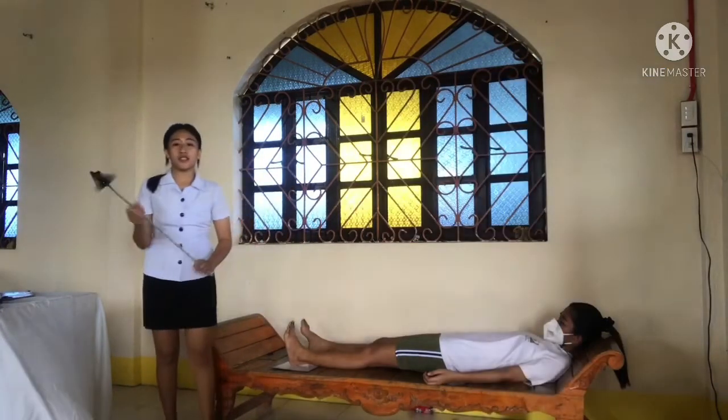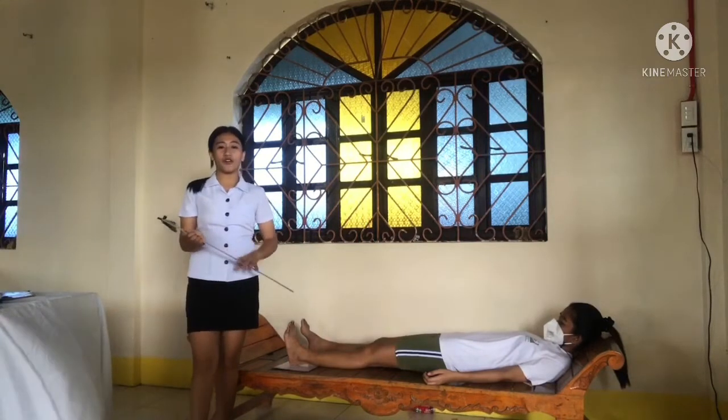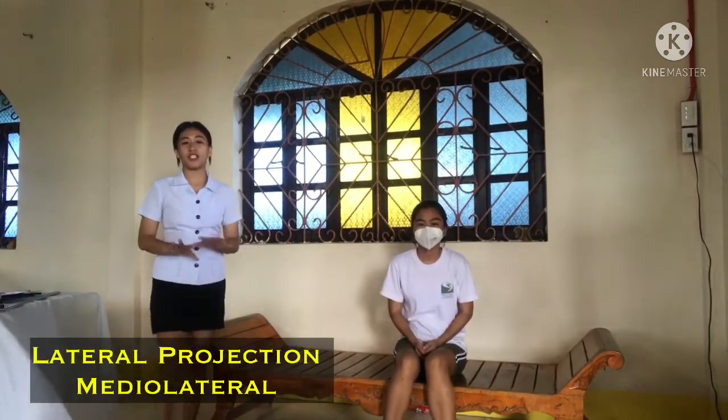So, this shows a true AP projection of the ankle joint, the distal end of the tibia and fibula, and the proximal portion of the talus. So next, the lateral projection of the ankle, mediolateral. So the IR used must be 8 by 10 inches.